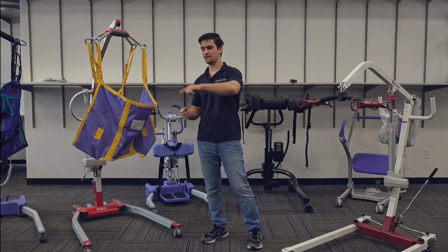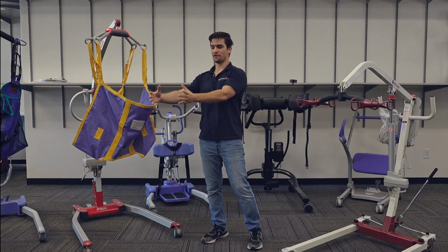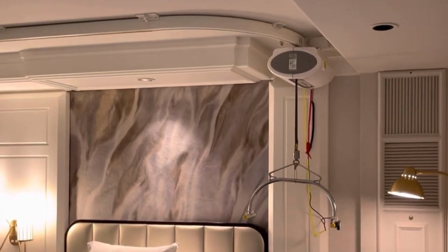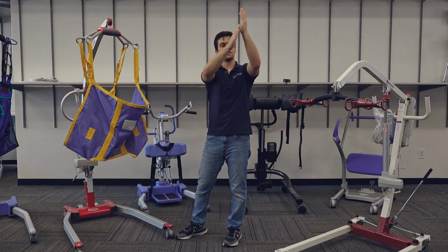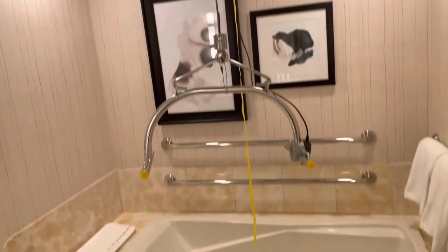So another form of patient lifts would be what they call a ceiling lift. A common ceiling lift is what they call the arching ceiling lift. So it's almost a U shape, where you have the bed on one side and the wheelchair on the other. The alternative kind that they do is the ones where it's actually mounted into the roof of the home and it's on a track. So we're able to lift that user from their bed onto the track and then they begin sliding across the home, either say to their wheelchair, into their bathroom, to their shower. But one like that's a lot more complicated and it's not as common.